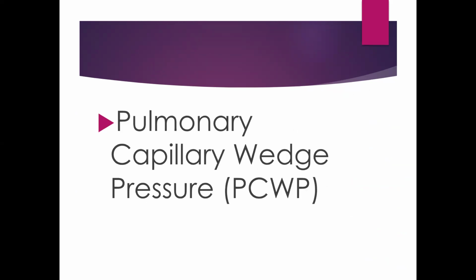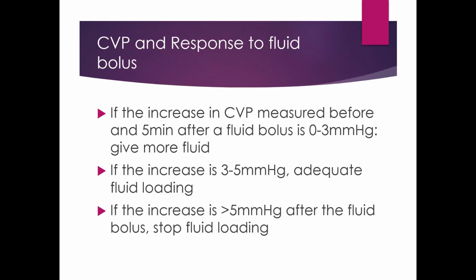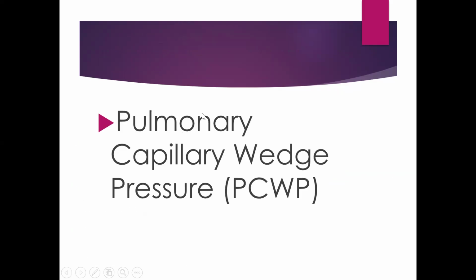Like I mentioned, each of these monitoring parameters can actually be a full presentation. We were talking about central venous pressure. We could have talked about insertion and the different routes, but just because it's part of hemodynamic monitoring, we restrict ourselves to this. But if you have any questions, we can discuss at the end of the presentation.